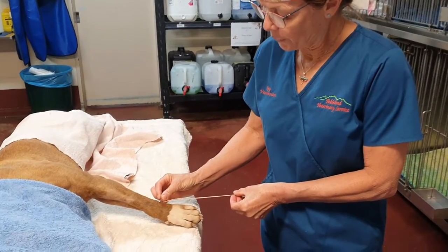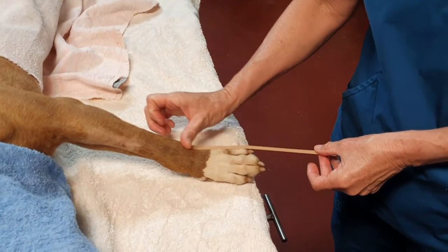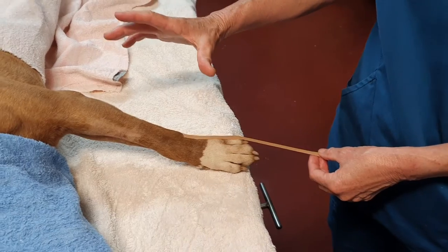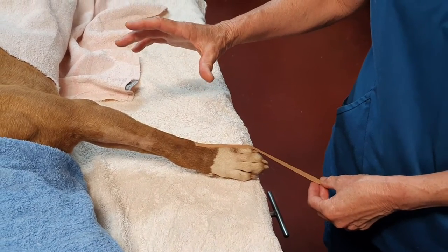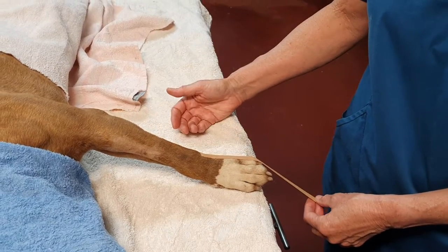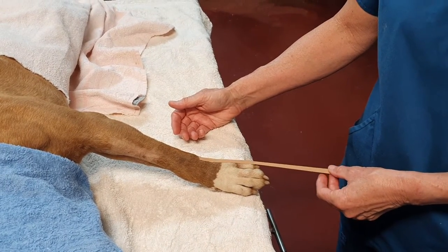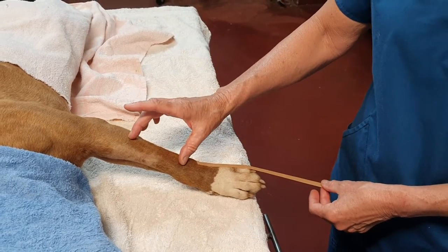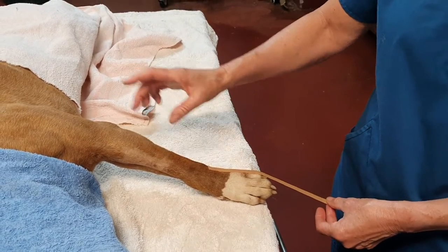So we're going to be putting on stirrups — just little stirrups. One comment about stirrups is if this is a lateral splint that is planned to be temporary until such time as surgery for a primary repair is made available, try to avoid putting the stirrups over the potential incision site for the surgery.